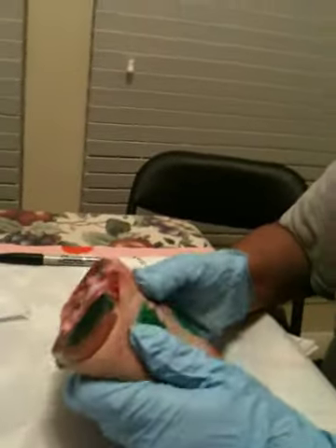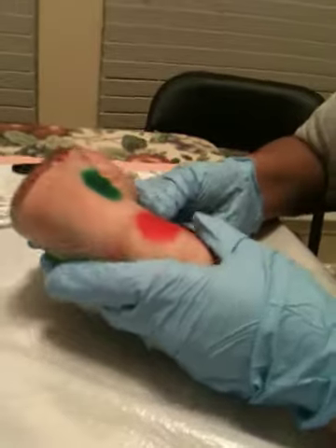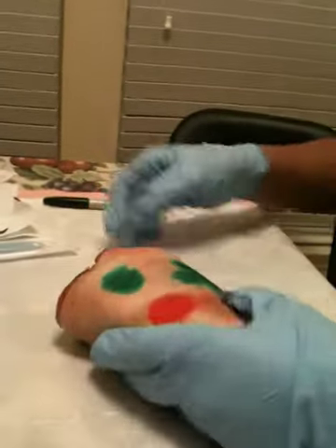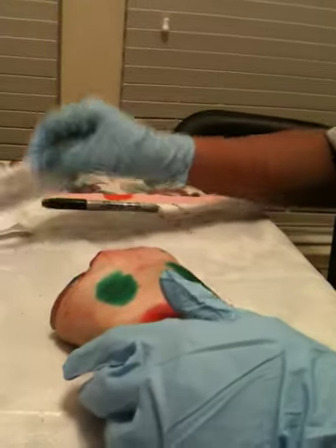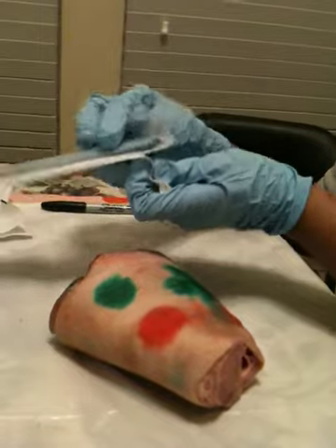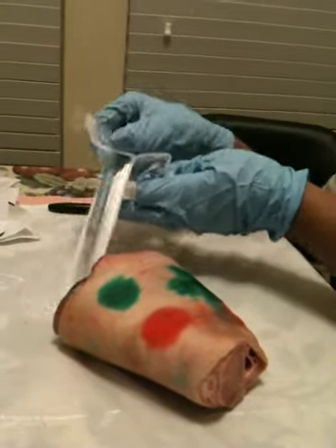Okay, the next step that I'm going to do is to demonstrate the shaving. So for this, I'm going to use the number 10 scalpel.